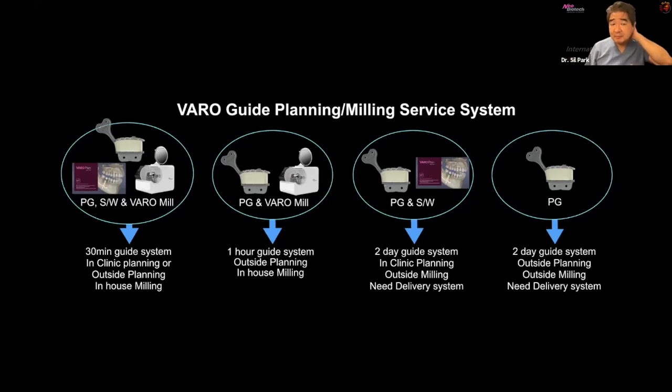When my patient comes in, right? If the patient is really in a hurry and wants it express, then usually I can do the surgery within 1 hour, from the very beginning to the end. Or, since I have a next patient waiting, what I can do is get that info, see all the other patients, and the next day afternoon, I see the patient.